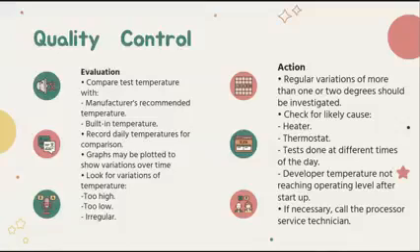What are the likely causes? Here, siya si heater or si thermostat. So si thermostat is responsible for automatically regulating the temperature of your developer. Tests done at different times of the day. So it is important that the test be done at the same time of the day. So preferably start up of the machine, and developer temperature not reaching operating level after start up. Okay, if necessary, call the processor service technician.